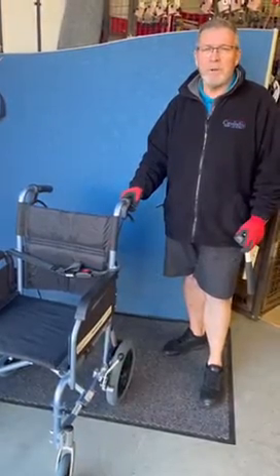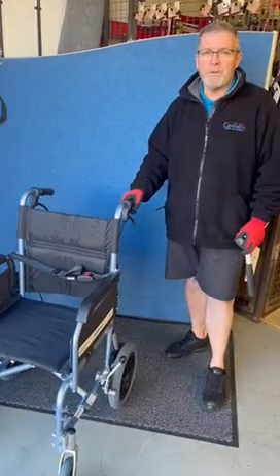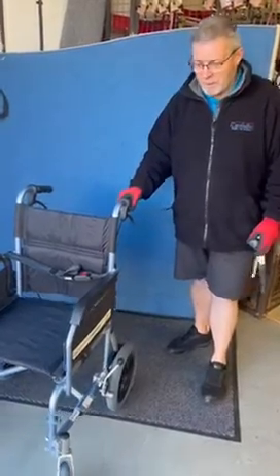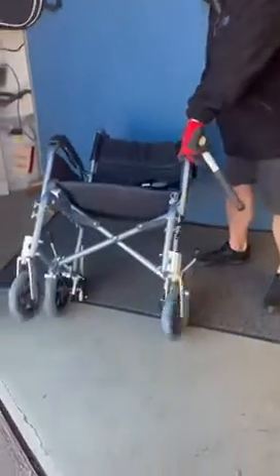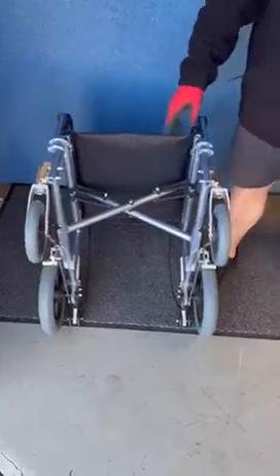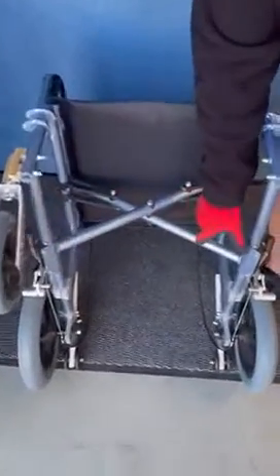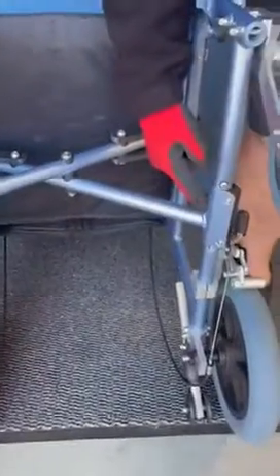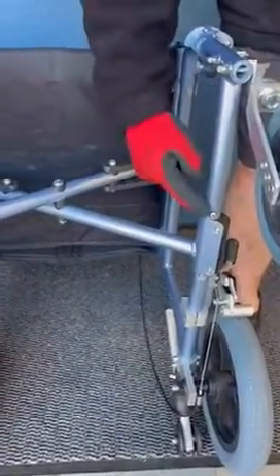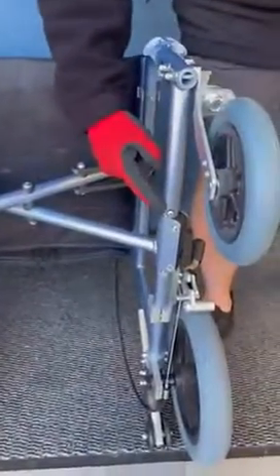And this afternoon we're going to look at one of your wheelchairs that may have become misaligned and how to fix it. First thing you do is put the chair on its back so that you can see the problem under the chair. And the problem that you will see is this part of the chair has gone forward over the two rivets. Might be one side, it might be the other side.